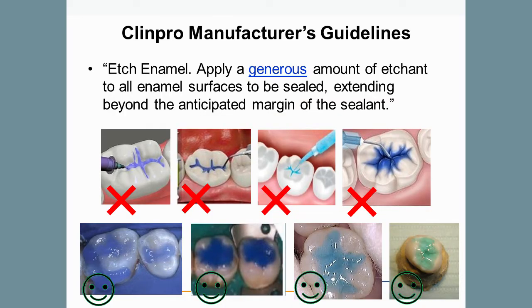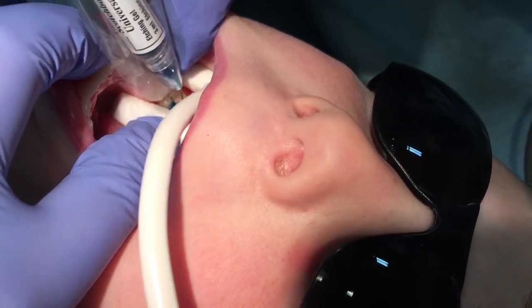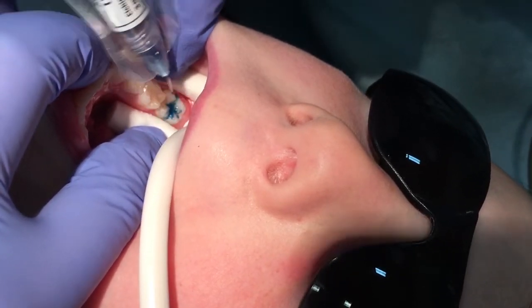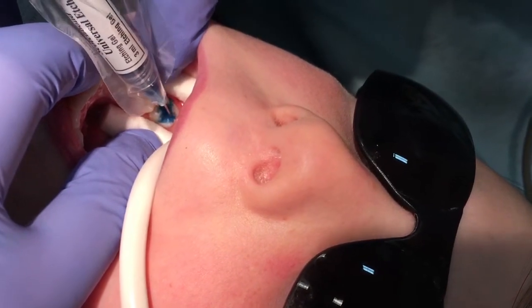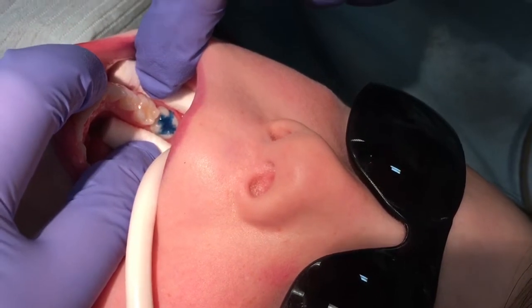Then apply a generous amount of etchant. The etchant is to extend 2 to 3 millimeters past the intended margin of the sealant. Don't skimp on the etchant. Notice how much etchant is used on the ClinPro application video. Apply the etchant and gently and continually tap the etchant down into the pits and grooves of the occlusal surface for at least 20 seconds to ensure the etchant contacts the deepest areas. Etchant is often viscous and may just sit on the surface, leaving unintended voids underneath. Tap the etchant down into the tooth gently, but don't scratch it in, as that can damage the tooth's surface.